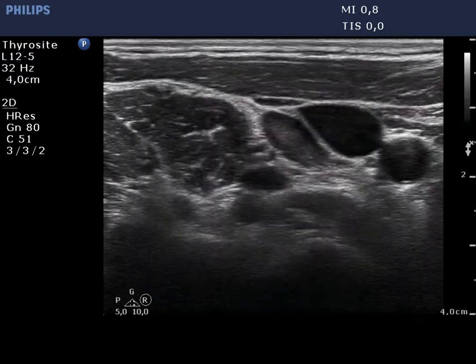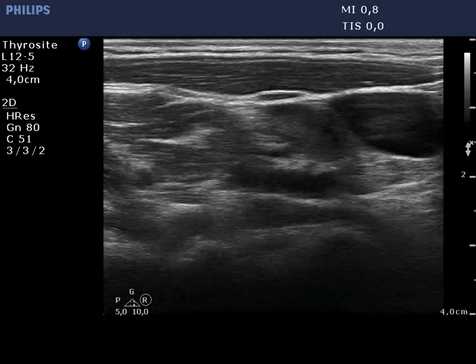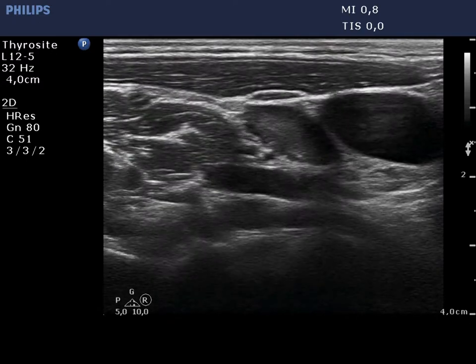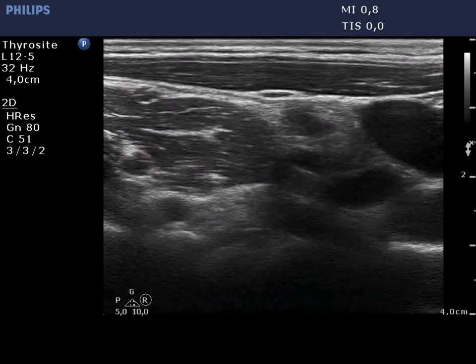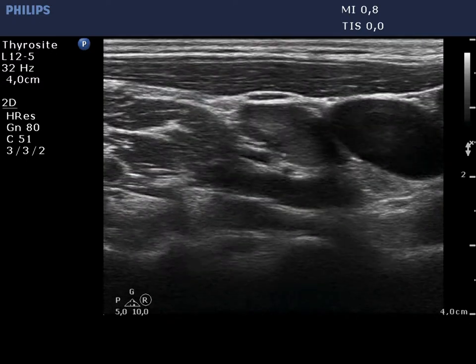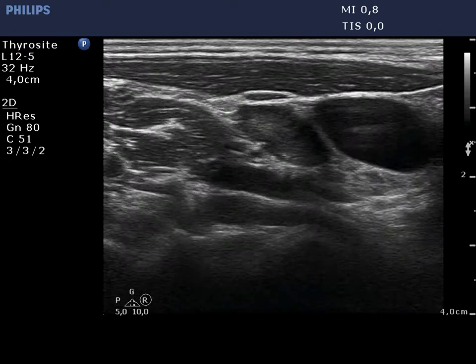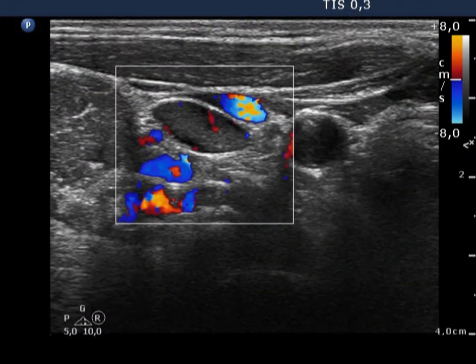The node is located dorsal and lateral to the vein. It is oval in shape and displays not an intact but a fragmented hilum. The vascularization is not specific.